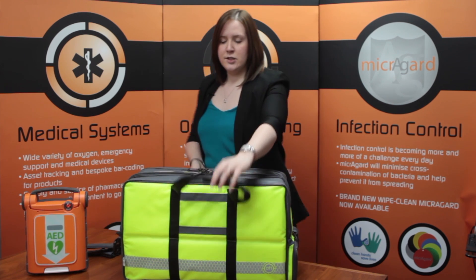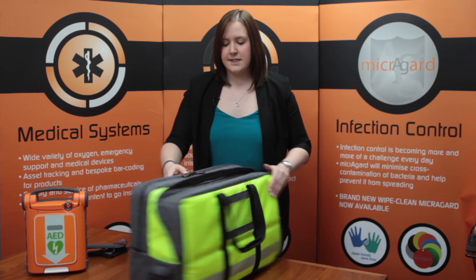Hi, my name is Sam and I'd like to talk to you about our large oxygen backpack. The bag is split into two main sections and the front has an angled zip opening allowing the kit to be easily accessed and seen.